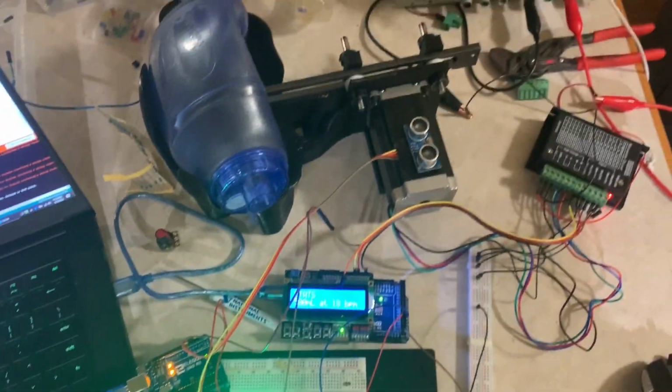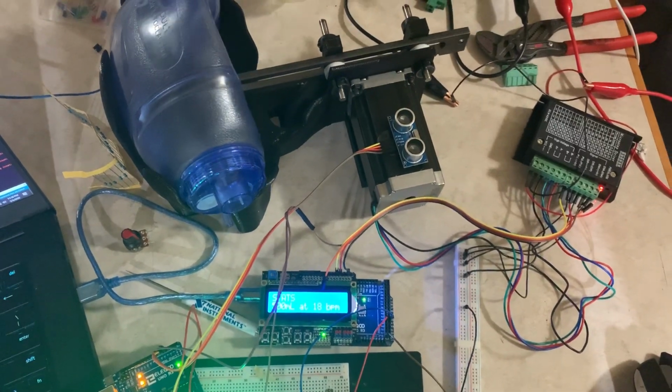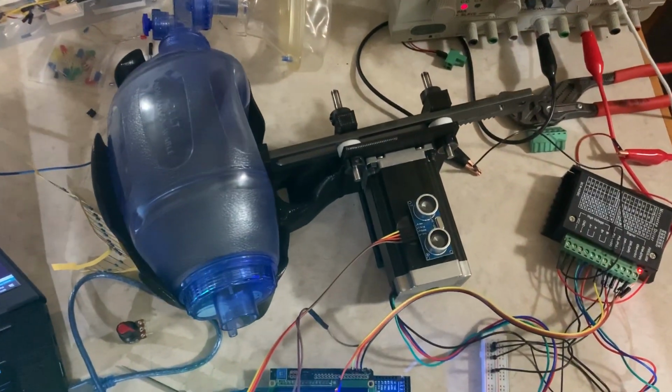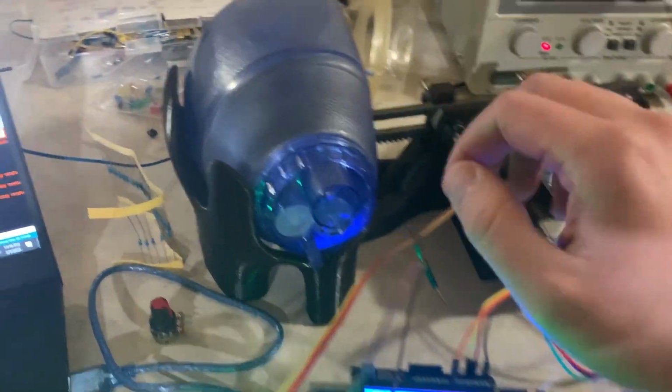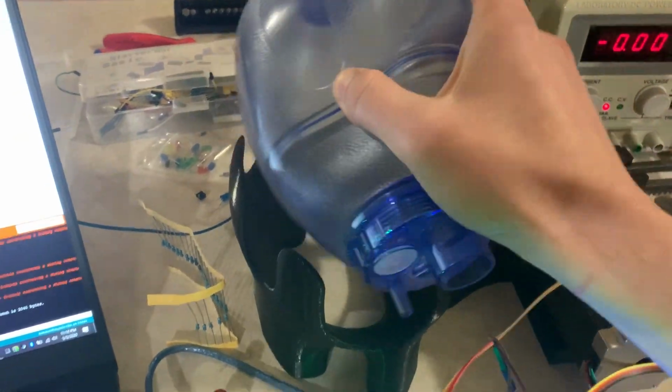Alright, here is my controls project. It is a mechanically actuated AMBU bag. So there's a rack and pinion that I designed myself in this nice little cradle for the bag, and it compresses this bag to give air to a patient.